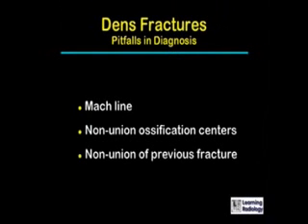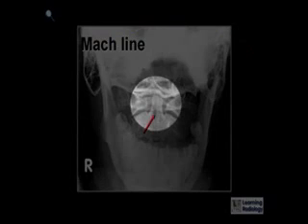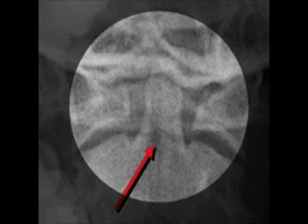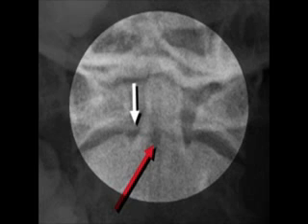There are several pitfalls in the diagnosis of a dens fracture. There may be something called a Mach line which may imitate a dens fracture, there may be non-union of the ossification centers of the dens on a congenital basis, or there can be non-union of a previous fracture of the dens. The red arrow points to a black line called a Mach line, produced as a manifestation of the rods and cones in our retina and our occipital cortices, but not present anatomically. Mach lines always occur adjacent to large white structures — in this case the neural arch of C1. If you're unsure whether it's a fracture or a Mach line, look at the lateral radiograph — the Mach line will not be present there.